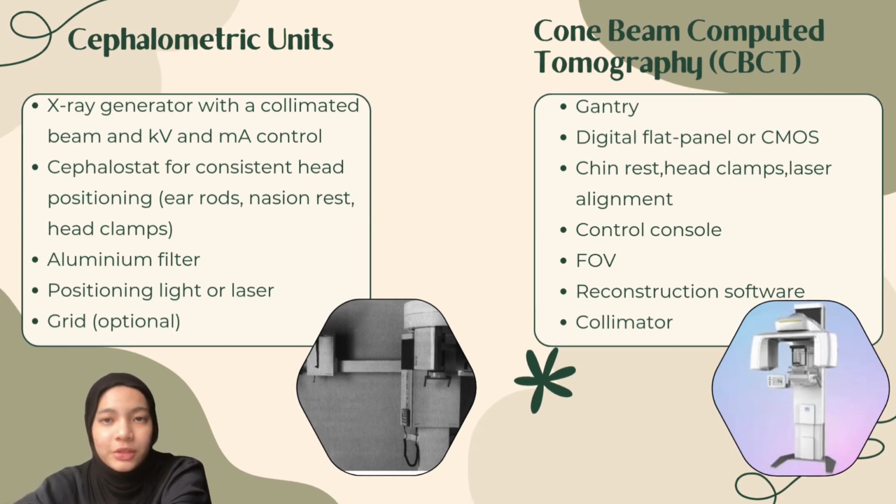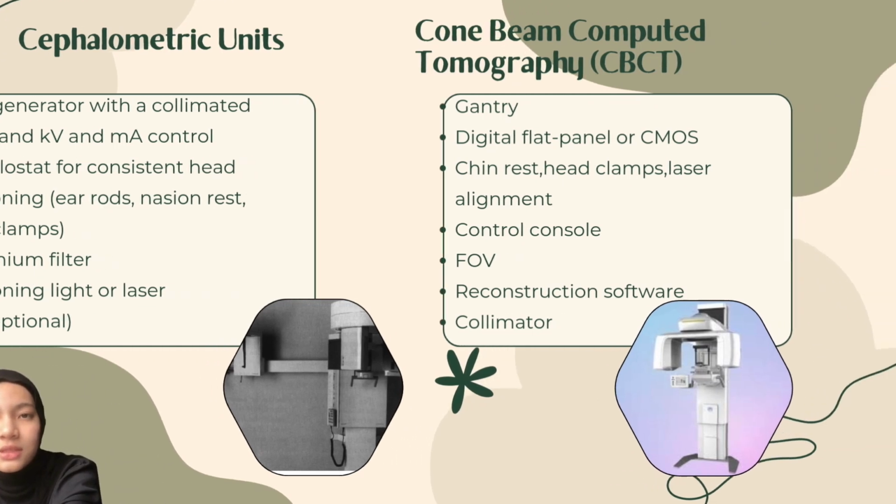Lastly, cone beam computed tomography (CBCT) delivers detailed 3D imaging. It includes a gantry, a digital flat panel detector, laser alignment for precision, and advanced reconstruction software for image processing. In conclusion, the combination of these components and modalities ensures dental professionals can capture precise diagnostic images to aid in effective treatment planning.